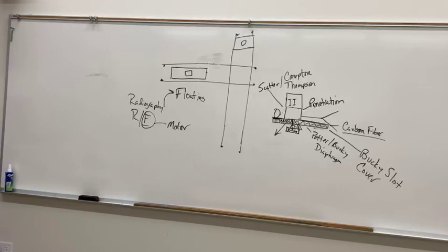All right, so overhead crane, two sets of rails perpendicular to each other. Any questions on all that? Just the basic room setup.